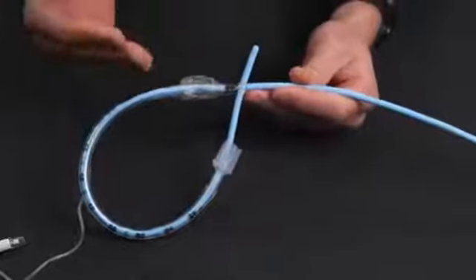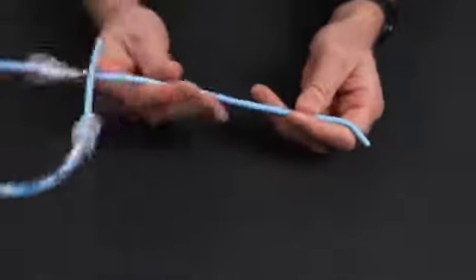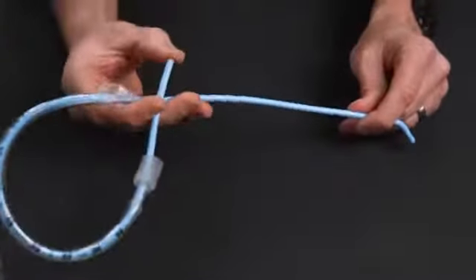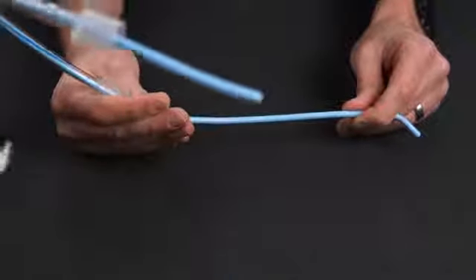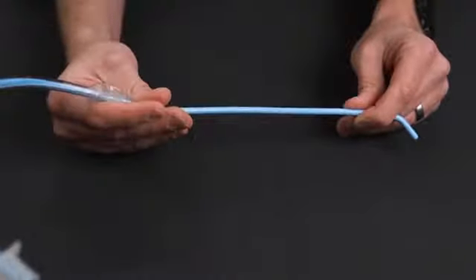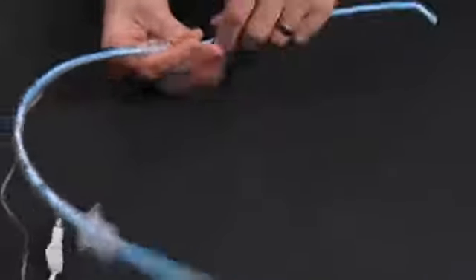It can be initially a little bit difficult to get in there, but what this allows you to do is it keeps the bougie and the tube in place. It's not sliding around. You can insert, and when you have it inserted, you can just take this with your thumb and you can get the bougie out and free one-handed if you don't have a partner to help you. So it just makes it a little bit easier when you're performing the procedure.